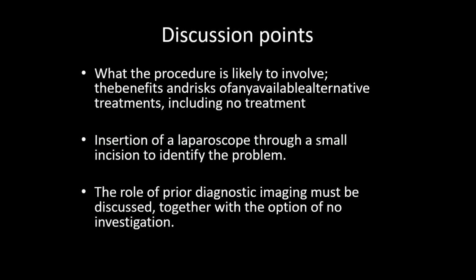Dr. Rana: laparotomy, if there is no experienced surgeon who can deal with the problem laparoscopically, or the patient is vitally unstable. Otherwise, you will manage through laparoscopy.